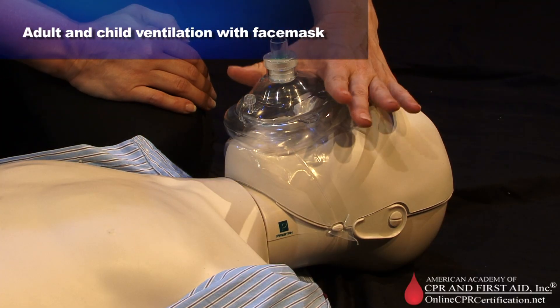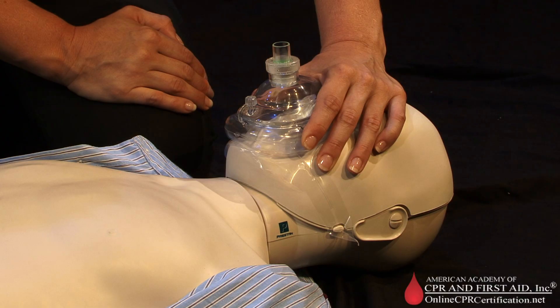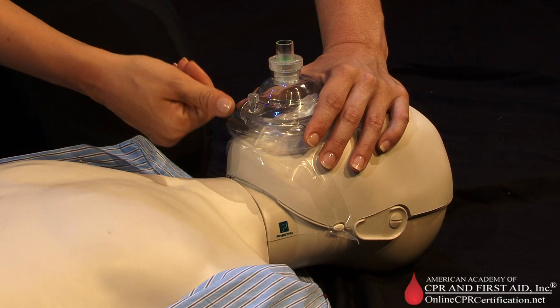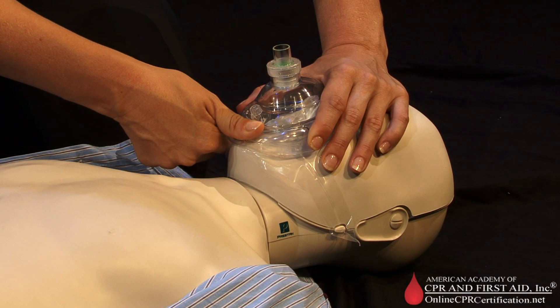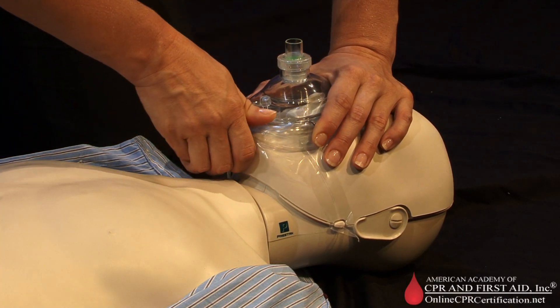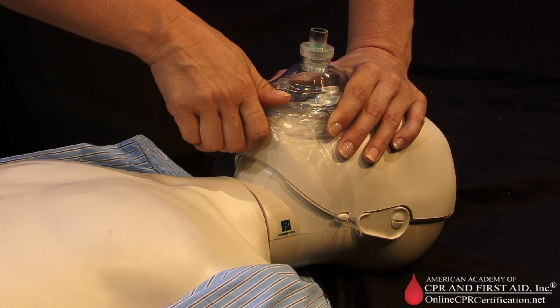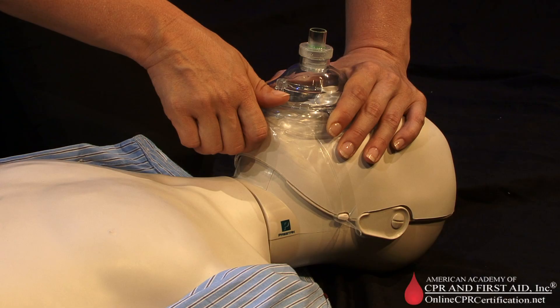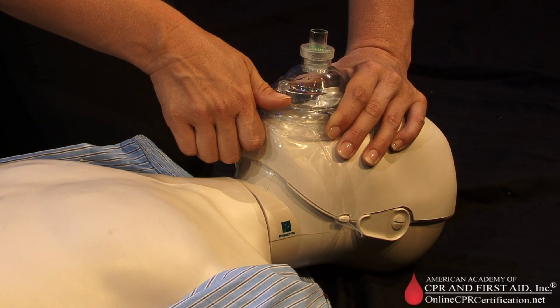Seal the mask on the face by placing your index finger and thumb closer to the top of the victim's head, forming a C shape along the edge of the mask, and press the thumb of the second hand along the bottom edge of the mask. Using the remaining fingers of your second hand along the bony margin of the jaw, lift the jaw to perform a head tilt, chin lift to open the airway. While you lift the jaw, press firmly and completely around the outside edge of the mask to seal the mask against the face.